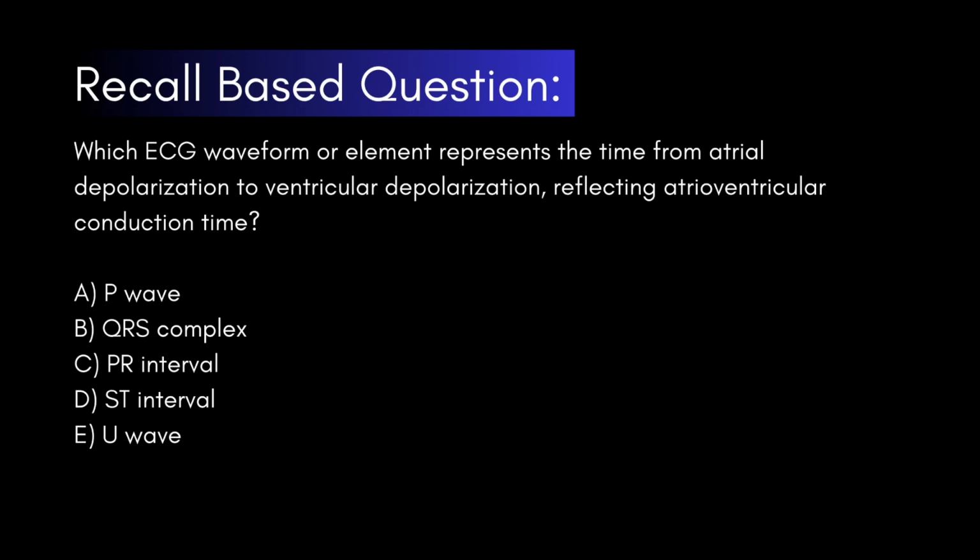Which ECG waveform or element represents the time from atrial depolarization to ventricular depolarization, reflecting atrioventricular conduction time?